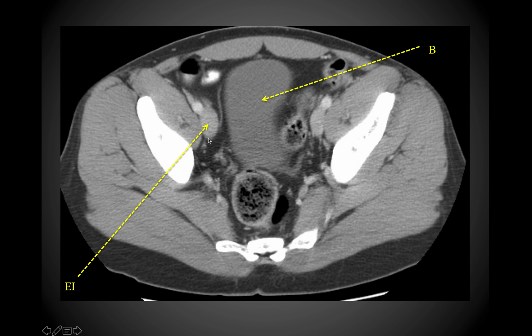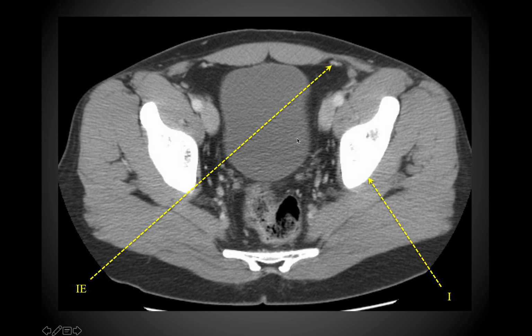Now we have the external iliac vein and artery again with the bladder here in the midline. Once again, you can see the rectum just posterior to that, as well as part of the sigmoid colon next to the bladder as well. Up here we can see the inferior epigastric vessels, and we're going to follow those as we descend, and eventually you'll be able to see the connection with the external iliac vessels as well.